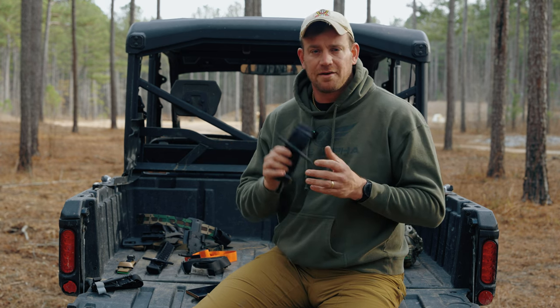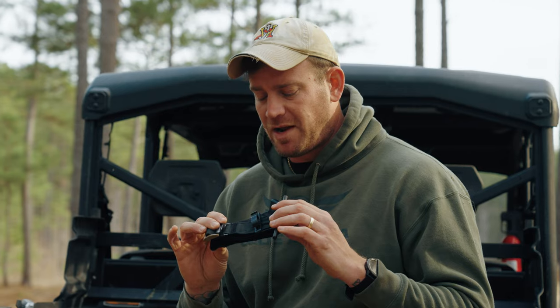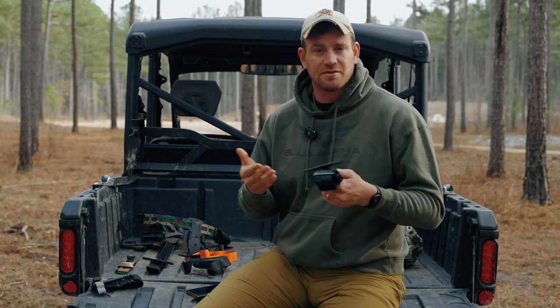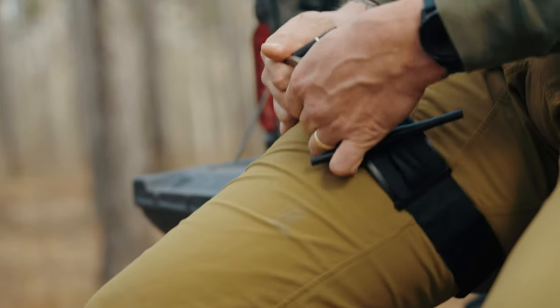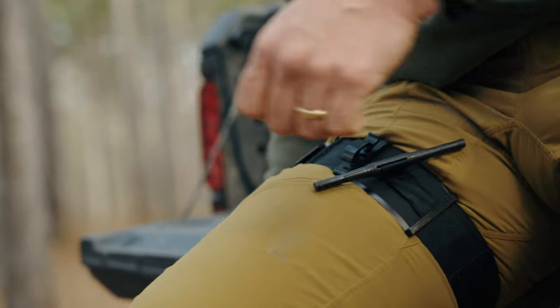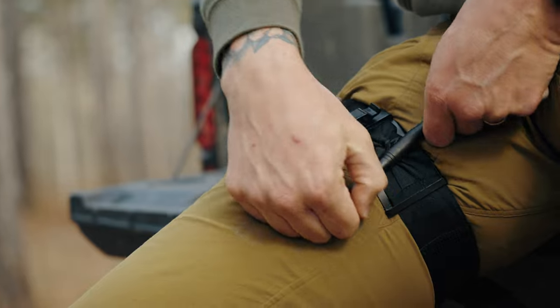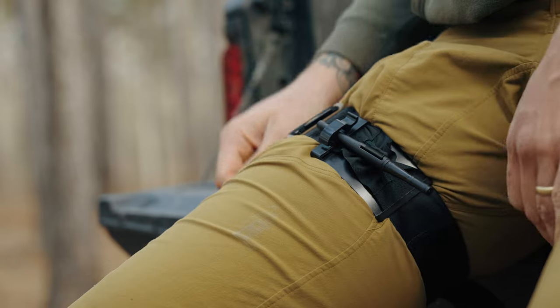Next up is the Tactical Mechanical Tourniquet. This is probably the widest one we have here today. It's still a very simple, very robust tourniquet. It has a couple of features that are really nice — it's just really simple when putting it on. The windlass clips into the retention clip super easily, and the actual polymer clip that goes around has a curved shape to it, so it fits onto your leg nicely.